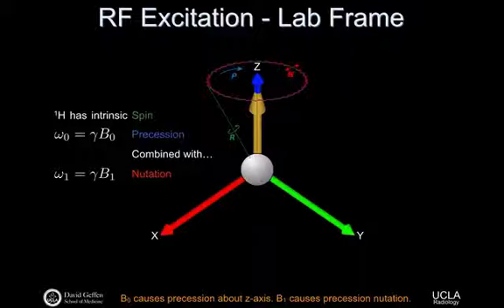During the process of excitation, especially if we talk about observing it in the laboratory frame, it's the B0 field that will impart the precessional behavior, what we think of as the sort of wobbling around at the Larmor frequency. The B1 field, it still has to follow the same physics, right? It's just a B field. And so that B field multiplied by gamma will define another precessional frequency. And that precessional frequency, is it going to be higher or lower than, say, omega 0?